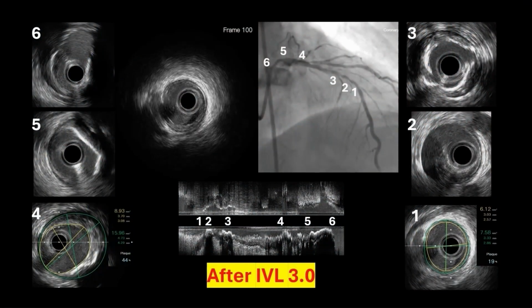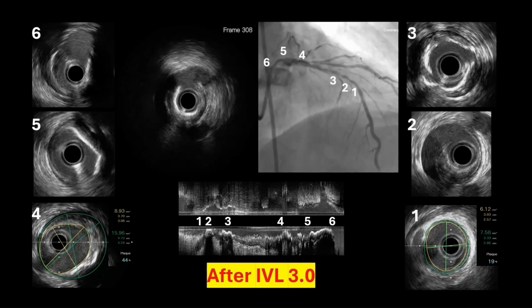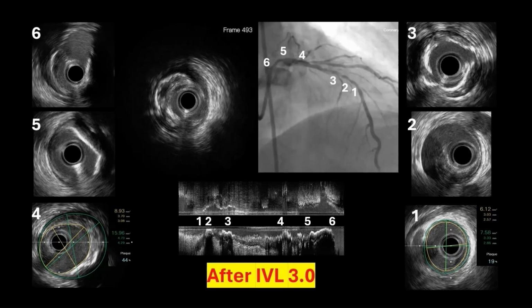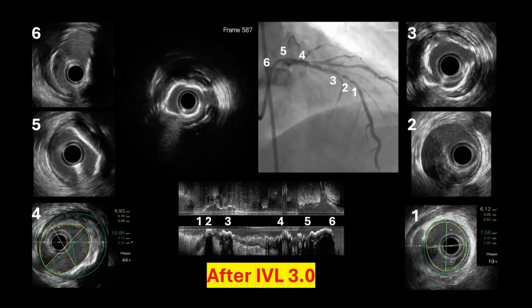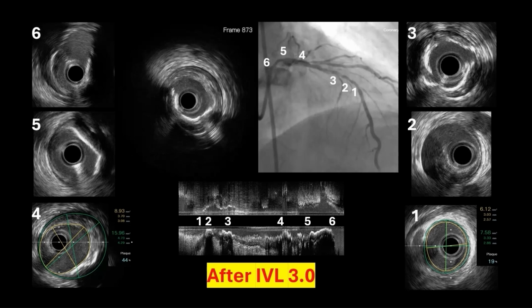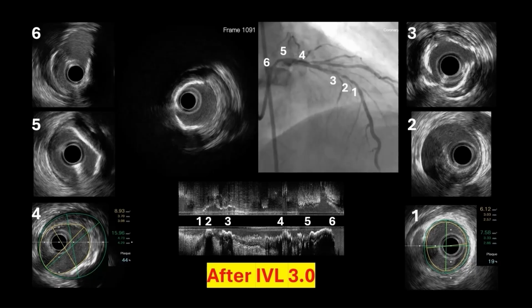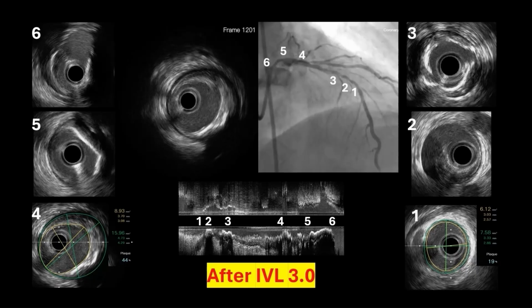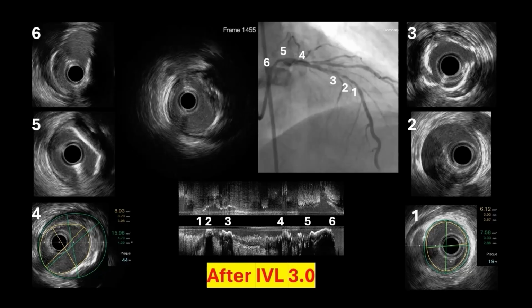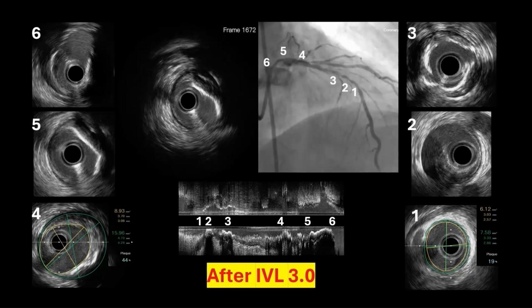After using the 3.0 mm IVL balloon, we can see that the LAD lesion had been significantly modified. There is evidence of dissection, along with multiple calcium plaques observed in the 360-degree calcified segment. In contrast, the left main and proximal LAD lesion remain unchanged because it's mainly characterized by unilateral calcium and a balloon size that appears too small for the vessel diameter. And we can see that the ostial portion of the lesion is still severely narrow, and the calcium plate had not yet been adequately fractured.